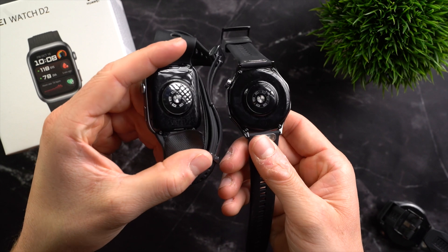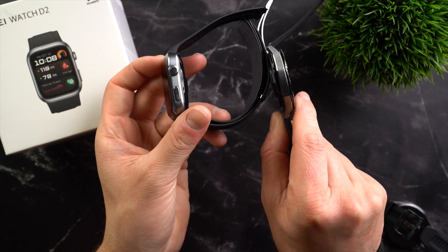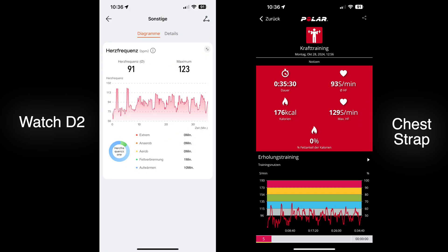We've already discussed the accuracy of the blood pressure measurement, but how accurate is the watch otherwise? One of the most central statistics is heart rate. The Watch D2 uses the same optical heart rate sensor as the GT5 and GT5 Pro, but the design affects heart rate accuracy somewhat. In my experience, the smartwatch was definitely accurate while running — the heart rate data aligns very well with the chest strap, as do the average and maximum heart rate values. During strength training there were expectedly larger deviations, but results were still above average in accuracy. The Watch D2 was somewhat less accurate than the GT5 Pro, but still significantly more accurate than many other smartwatches.